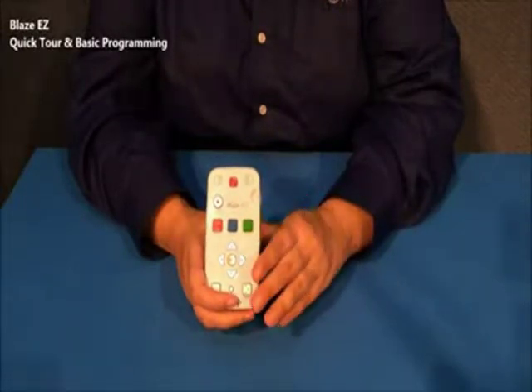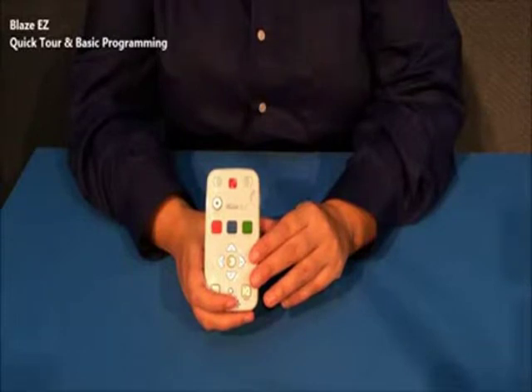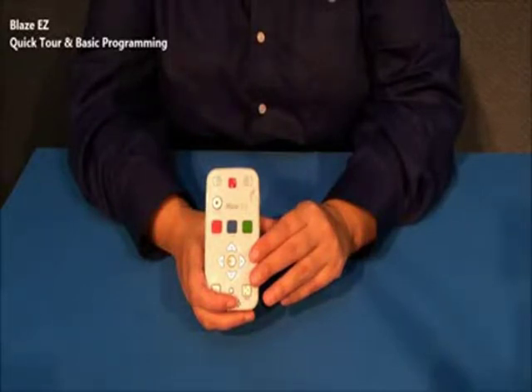Then the jurisdiction. And I let it play like that, although you probably didn't understand a word, because I wanted to show you something. The book reader actually remembers the speed and the volume at which you previously played the audio. So this is rather soft, and it's playing very fast because I recently played this audiobook very quickly.